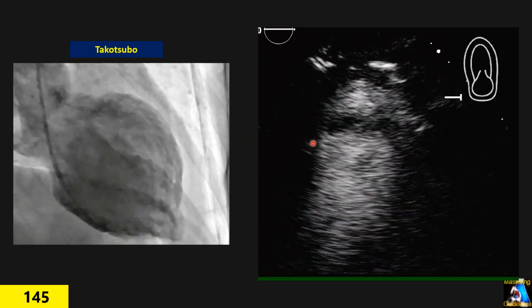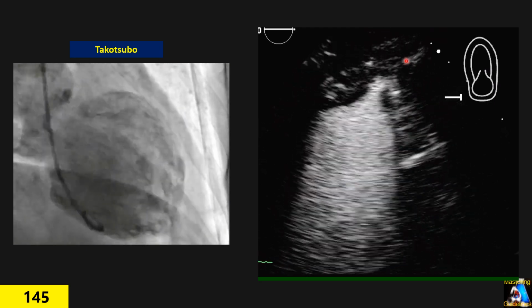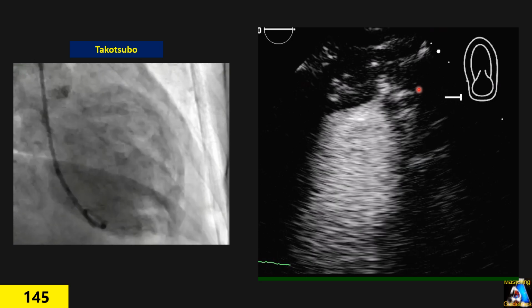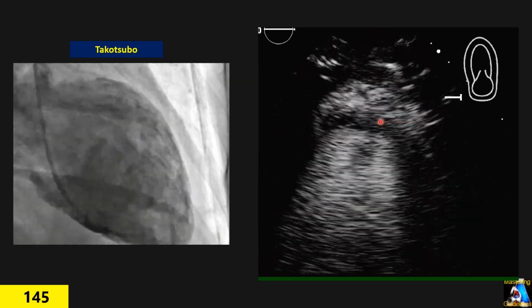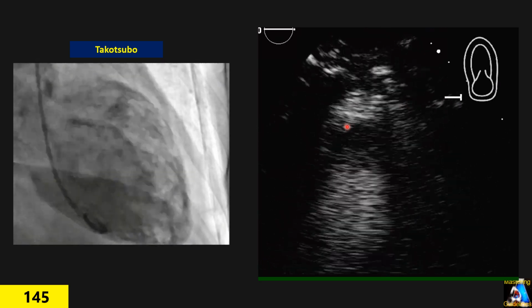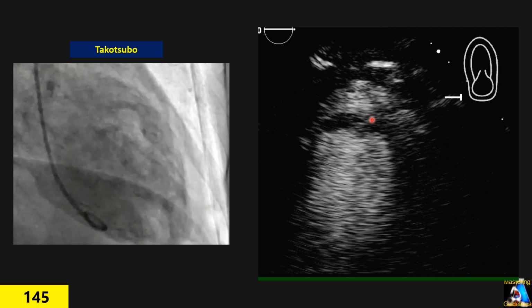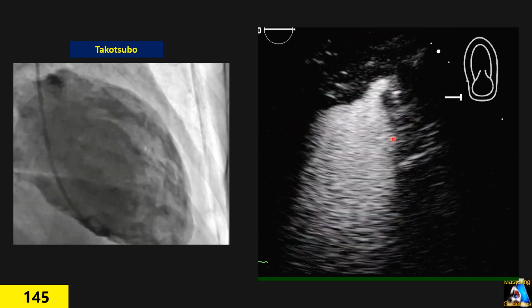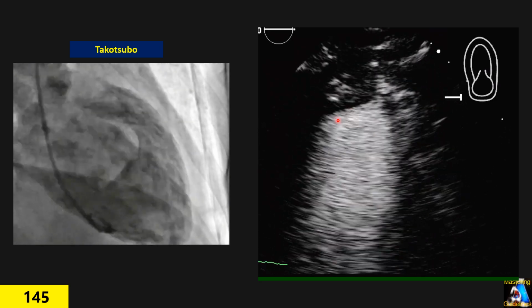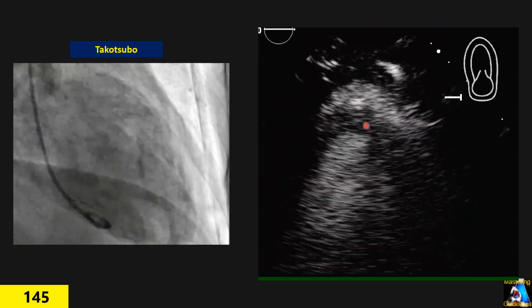So the territory up to here gives the impression of an aneurysmal shape, but the most important characteristic feature is this rupture of the myocardium at this level. Why does it sometimes disappear? Because during contraction, the plane of the sector changes, and it looks like a very strong contraction and it disappears. That is the reason.